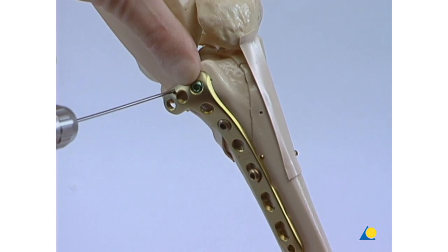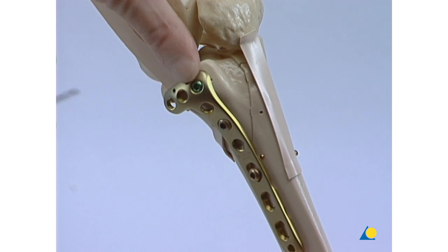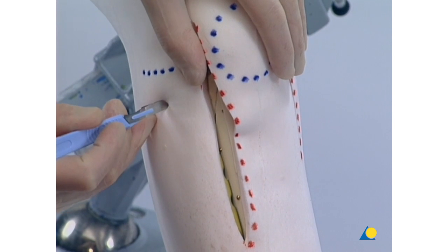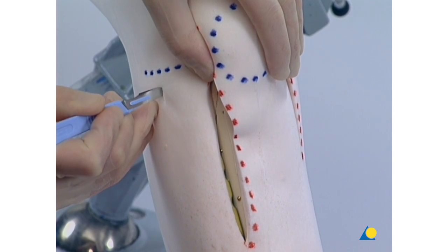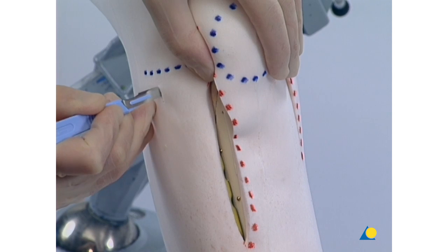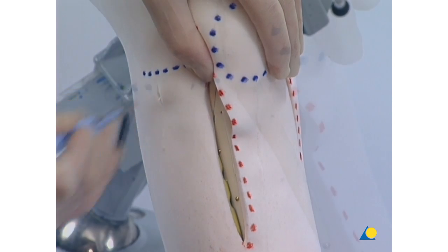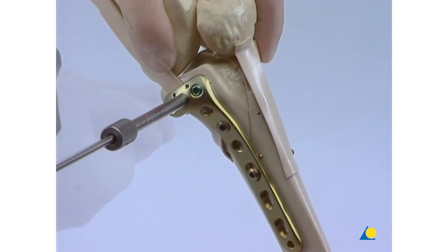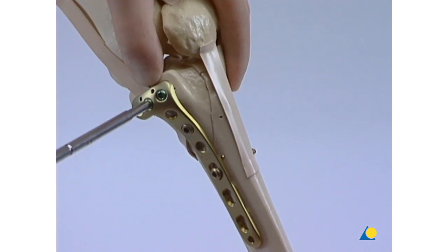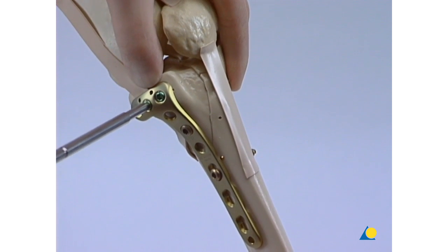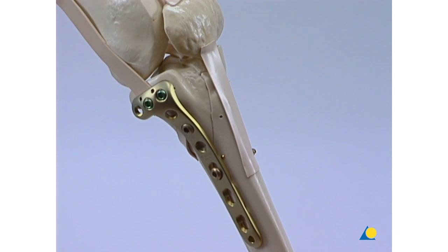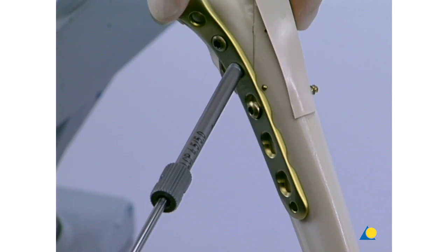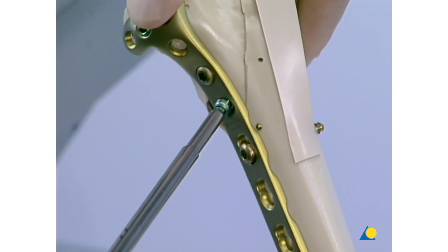The posterior K wire is removed. The more posterior plate holes in the L plate are usually hard to reach through the anterior incision. A separate stab incision is appropriate. A second locking head screw is inserted through the middle plate hole of the proximal end of the plate in a similar manner to the first one. The proximal fixation is completed by using a locking head screw just proximal to the apex of the fracture.